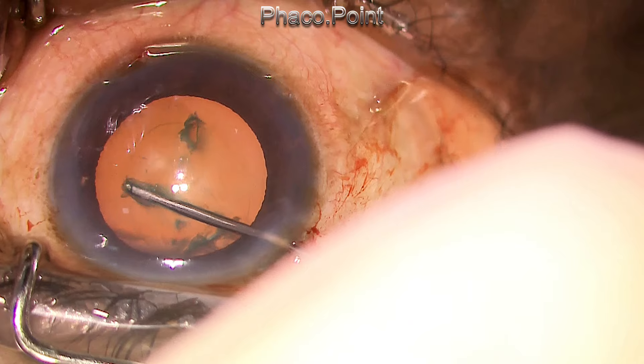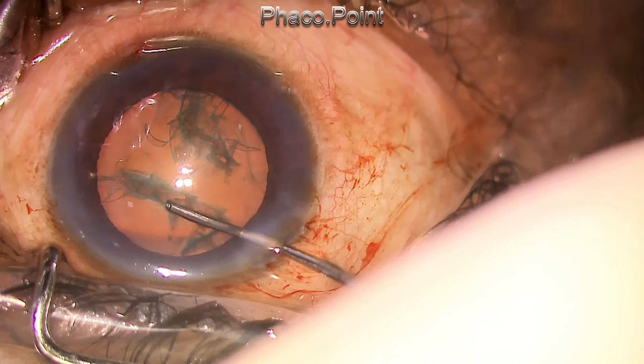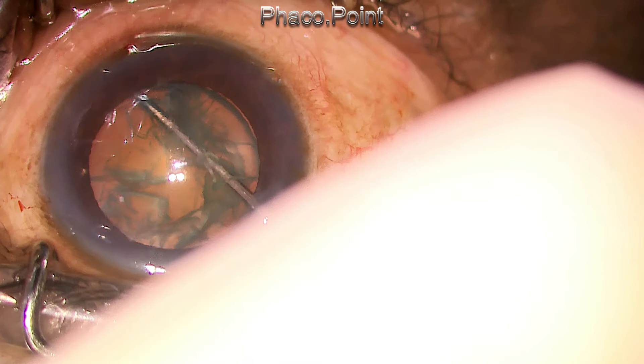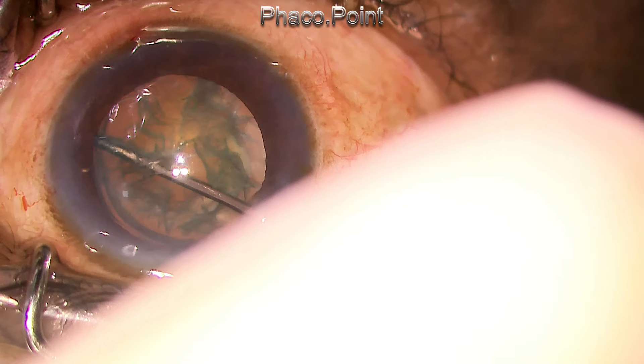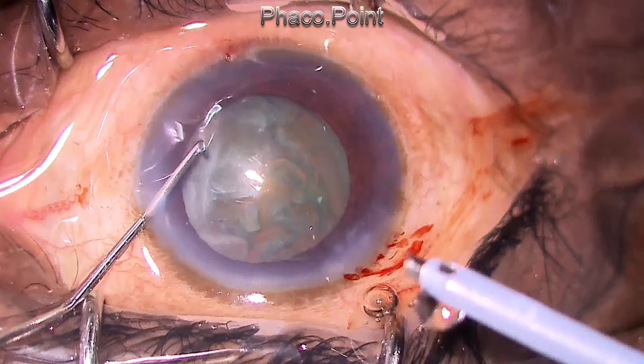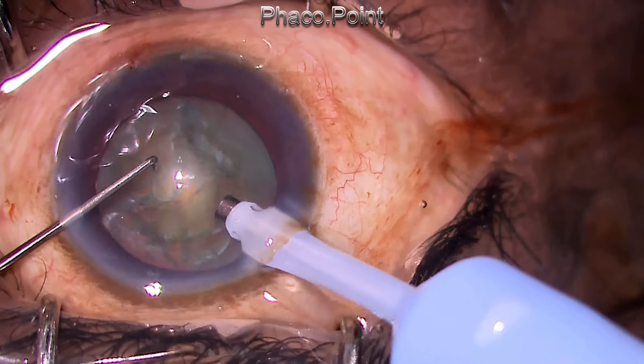Avoid hydrodissection at all costs. The cortical cleavage hydrodissection will create a hydrostatic wave passing between the capsule and the peripheral cortex, and this hydrostatic force can sometimes cause the rip to extend to the posterior capsule. Instead, just limit yourself to hydrodelineation and make sure that this fluid wave does not hydrodissect.